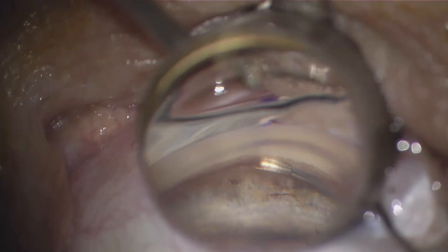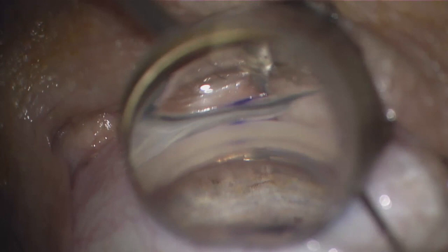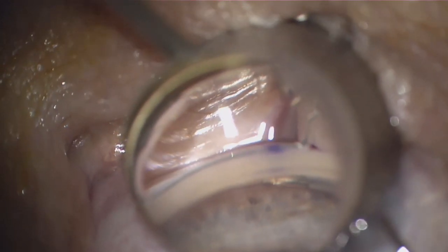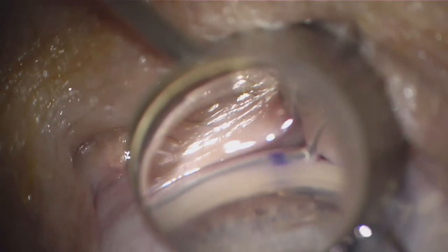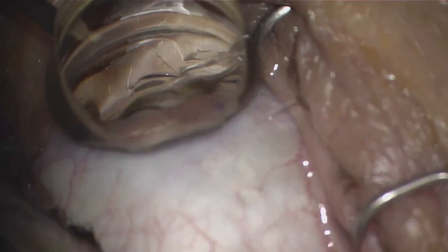Another important point is to ensure proper trabecular tissue engagement with the Hydrus Microstent cannula tip. The cannula tip should be placed against the top edge of the pigmented TM, angled anteriorly about 15 to 20 degrees. You can score the TM with the tip, though this is not necessary, as you can also, with back pressure, advance the cannula tip through the TM until the beveled portion is confirmed in Schlemm's canal, and the entry of the stent should glide and be smooth. If there is significant resistance, check the positioning of the stent. The good news is that the Hydrus can easily be retracted and repositioned as necessary.